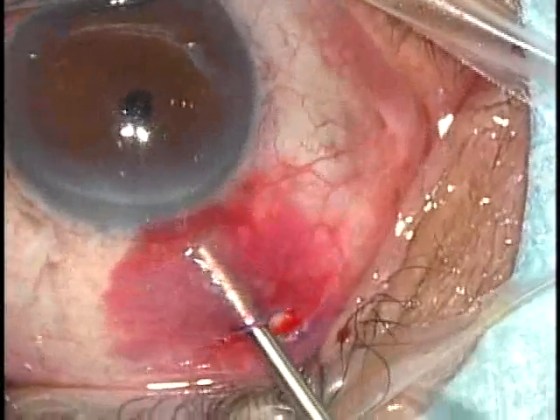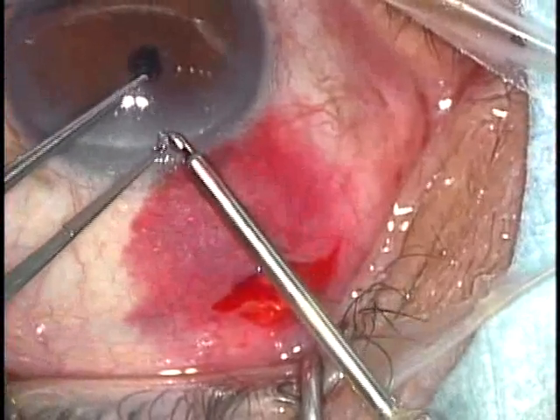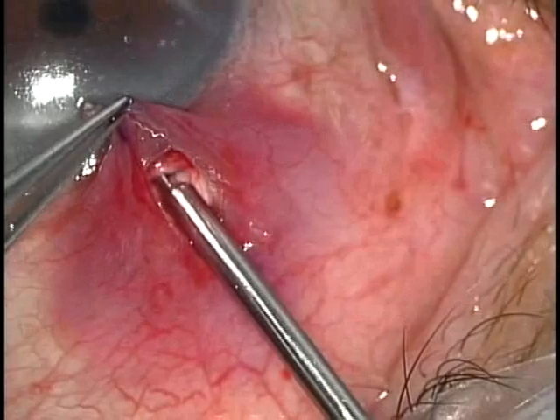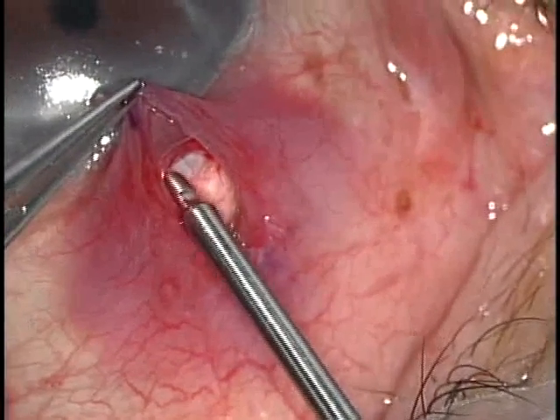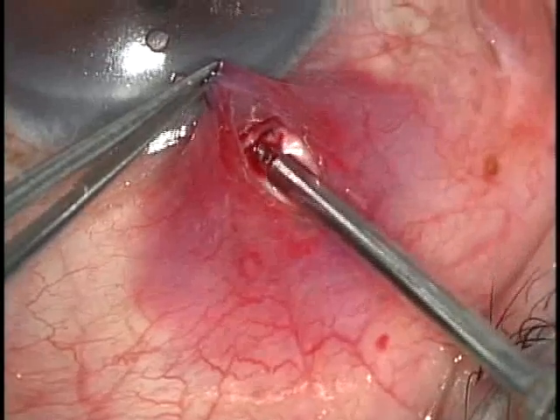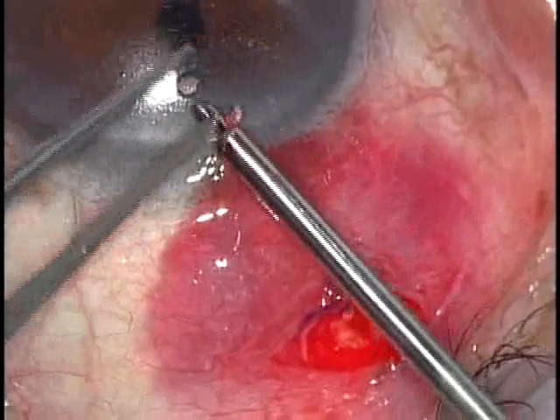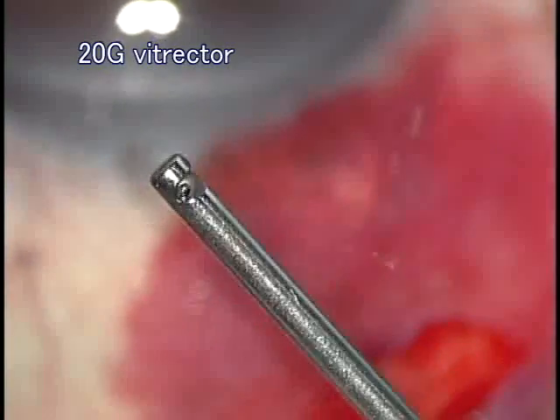With a pinch action, we can cut the trabeculum out and open a window to filtrate. The Fukasaku Micro Punch can control the size of the window with 2 or 3 bites to obtain the ideal reduction of intraocular pressure. Our partial guarded oblique tunnel technique has more outflow resistance than the standard full-thickness sclerostomy technique, so the final IOP is between that of standard trabeculectomy and full-thickness sclerostomy.